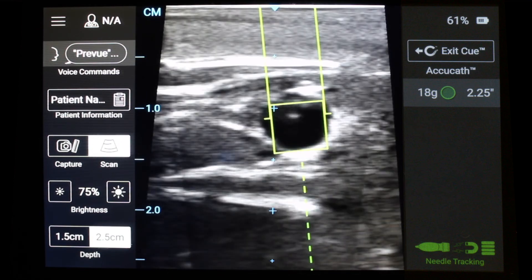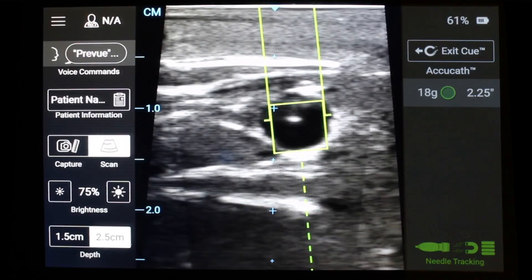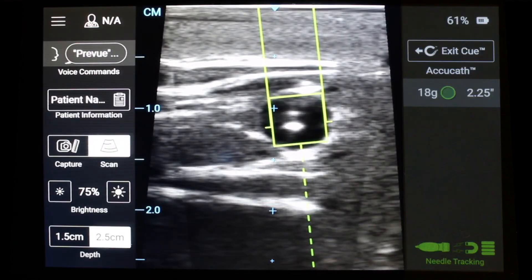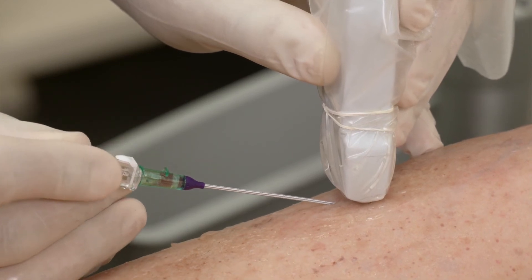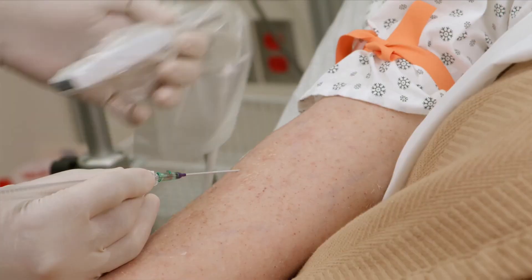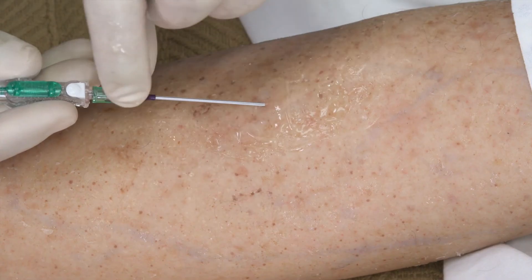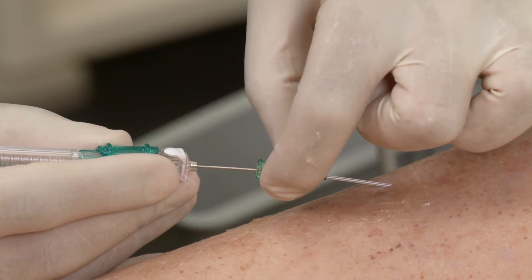Confirm vessel access using standard methods such as blood return and additional ultrasound indicators. Slightly lower the angle and slightly advance the needle tip further into the vessel. Now you are ready to fully advance the catheter into the vein as dependent on your selected vascular access device.